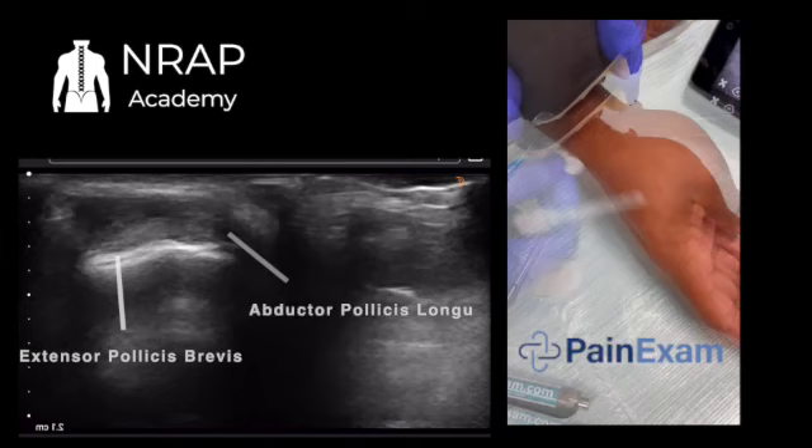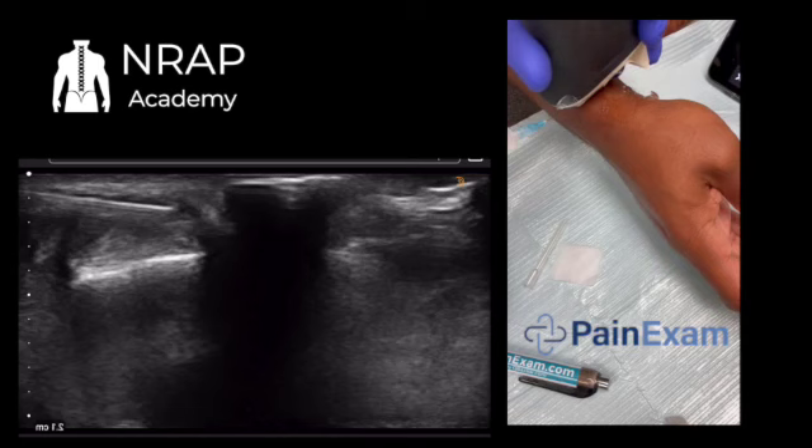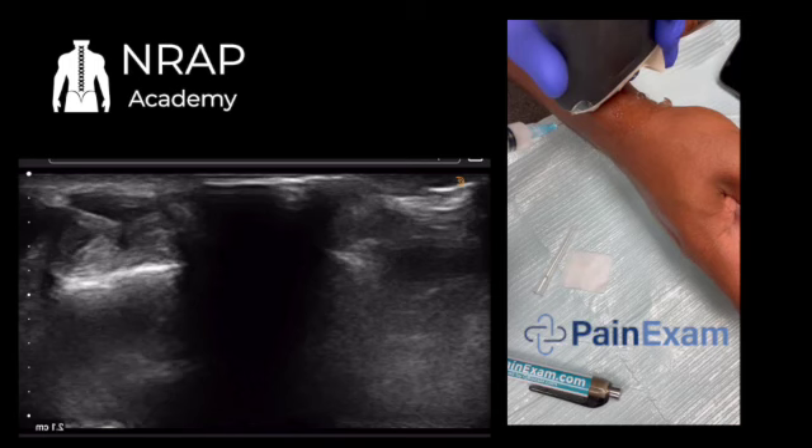Let's clean him up. I'm going to be on top. I'm going to work my heel high because I'm stepping around the tendons. Am I hurting? Nope. Now between the tendons — no sheath, no pain, right? I'm going to move.